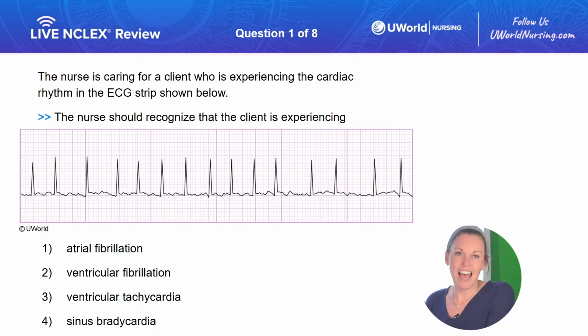Drop those answers in the chat. Again, if you guys are just logging on, just getting into the live, we are covering ECG strips today. One of the most requested topics, something I know I found to be very challenging and difficult in nursing school. So we hope we can break it down and make it a little easier for you guys today. We're glad to have y'all here. I'm going to hop into the chat myself so I can see what you guys are answering. And again, be sure you guys are sharing this session to all our viewers on TikTok. The more the merrier. We want to reach as many of y'all as possible. All right, let's see how we're doing. I'm getting the chat pulled up here so I can see how y'all are answering.